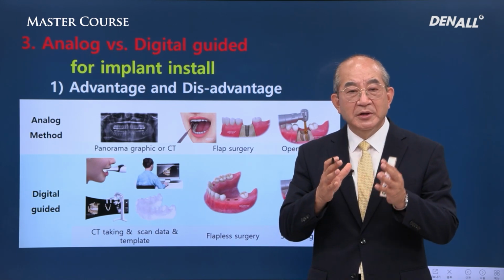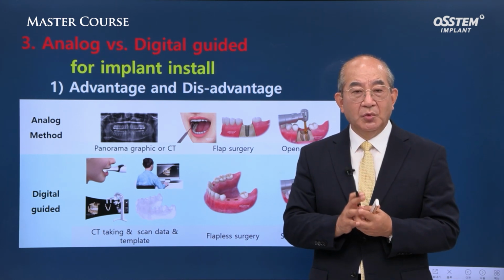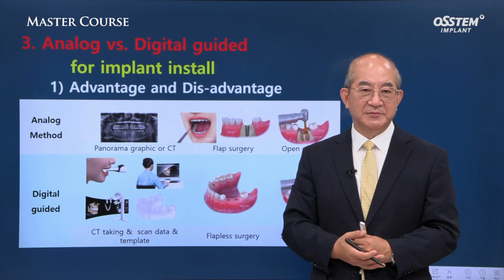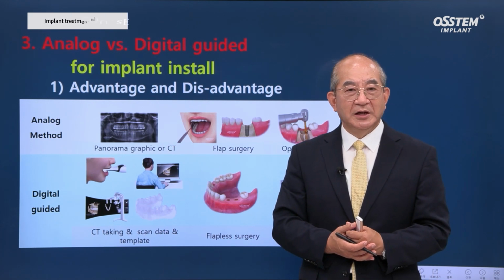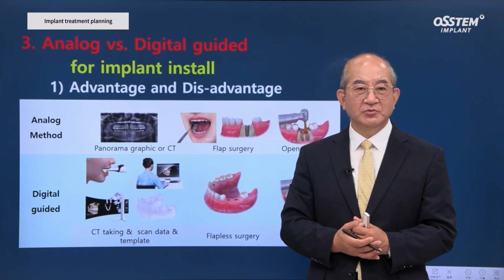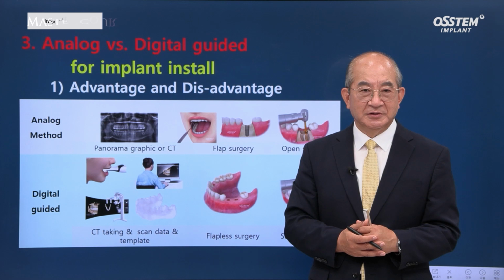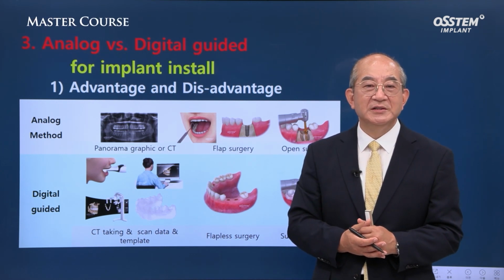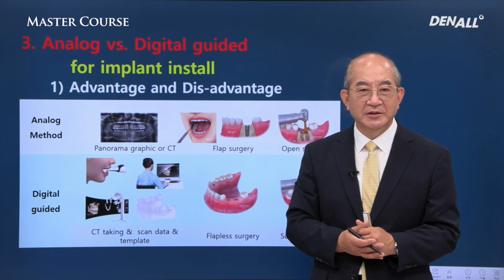If you use surgical guide, in most cases, you can do flapless surgery and reduce treatment time. You can get accurate results and surgical time will be reduced. Treatment planning is the topic I've talked about today. And the basics is that we need to center our treatment plan based on the top-down method. And I recommend digitally driven implant treatment planning.